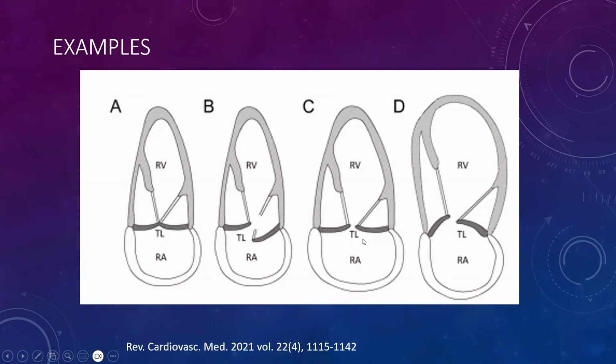Here you have where the atria is quite dilated, and you can see you have a flat coaptation. The ventricle is also a little bit dilated, but this is more of the atrial functional. And here is a good example of the ventricular functional, where typically the posterior leaflet tends to be a little bit more tethered, but it can be any of the leaflets, and usually multiple leaflets are tethered. It's more related to ventricular remodeling, although again, you can also have atrial dilatation. So it's important to try to understand what the mechanism is, and looking at how the leaflets lie helps you with that.